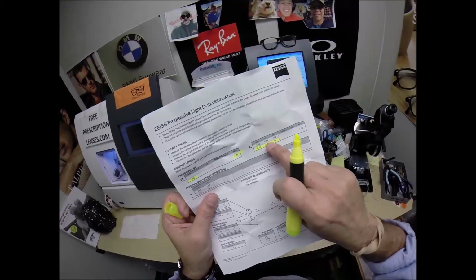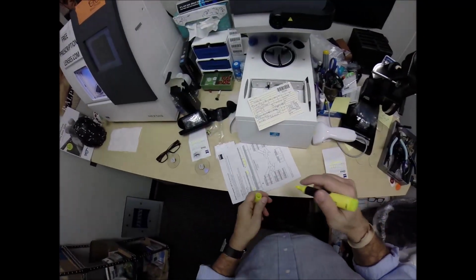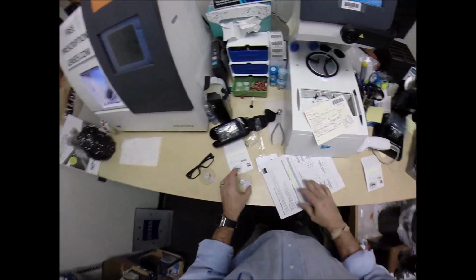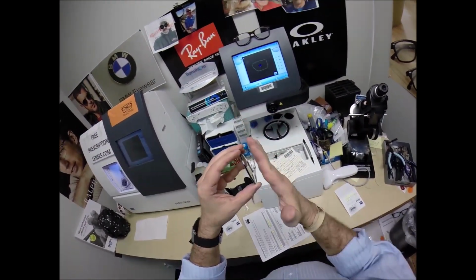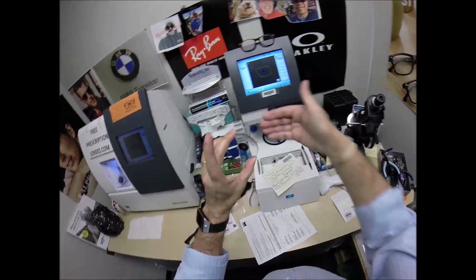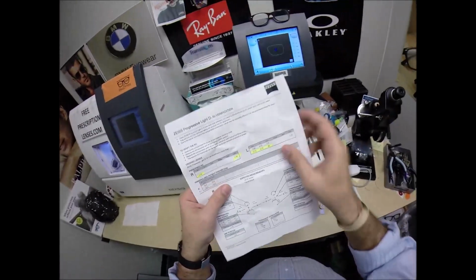So the top one is for plus cylinder. Your prescription is in minus cylinder. Years ago, and the lab equipment the phoropter that you sit in front for your exam, when astigmatism correction was on the front of the lens, that was a plus cylinder. Now that it's on the back, minus. Plus, minus.